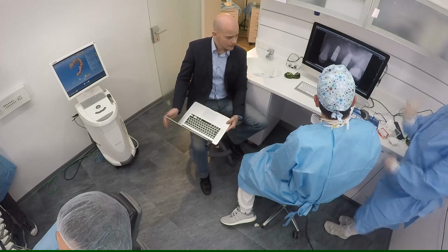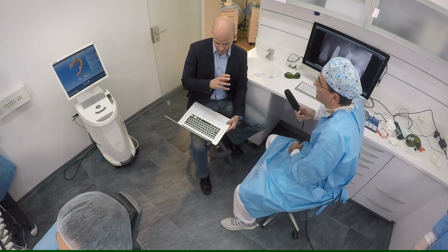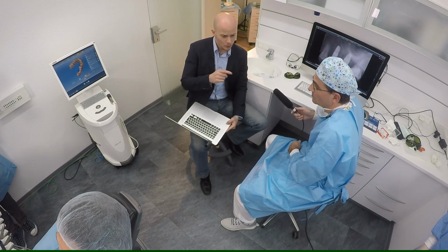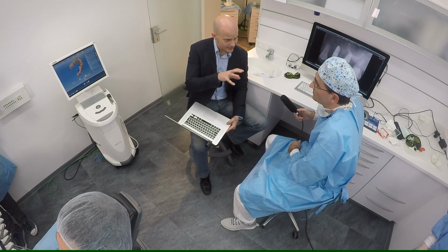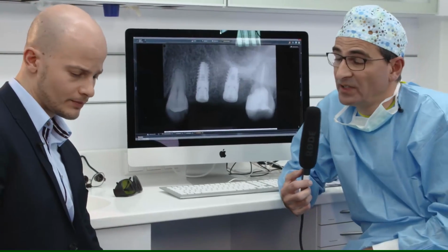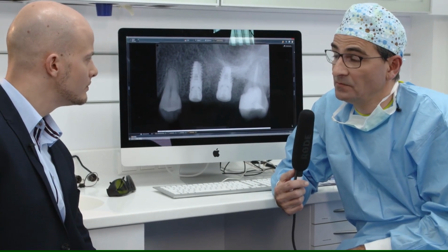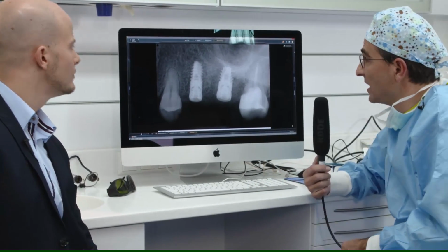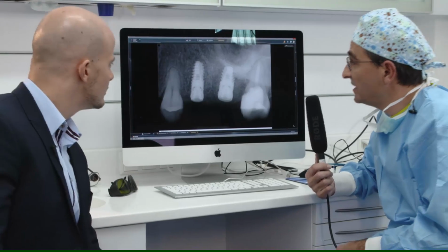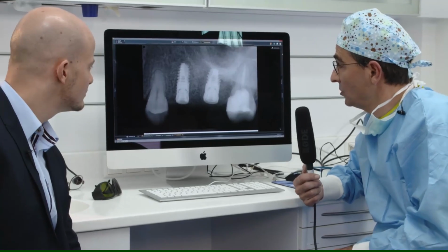Okay, I am just hearing from the director that we missed the first part of the answer. So once again, why the Xive system? The Xive system has really great primary stability. So we see here the result, and I think it's definitely the same as what we had in the planning. Yes, definitely. So everyone is happy.